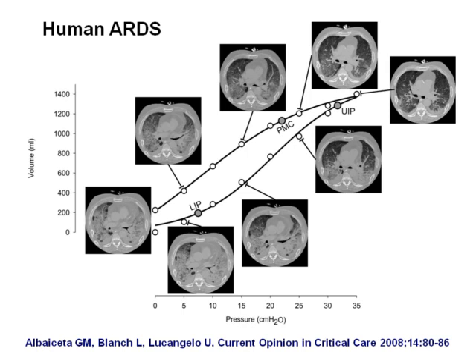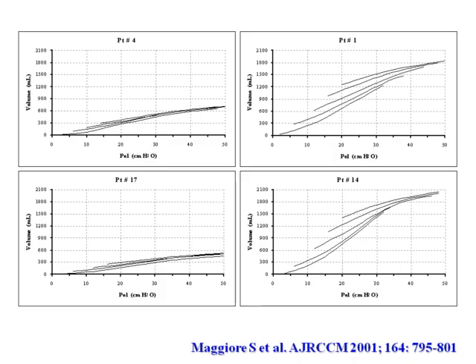So some people use that criterion to set PEEP in patients with ARDS. It can be used to set PEEP on the way down of the pressure-volume curve, or maybe to set PEEP here and let the lung, at each tidal breath, recruit to reach an equilibrium. And this usually takes minutes. So this can be useful at the bedside.